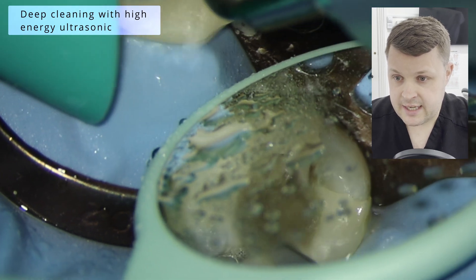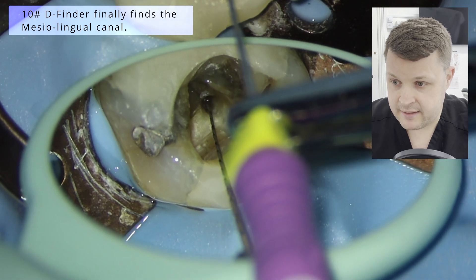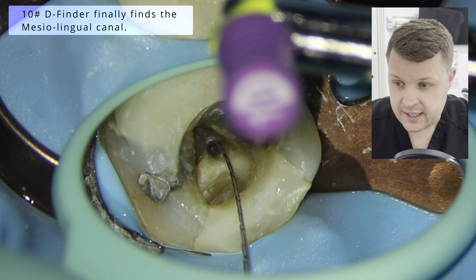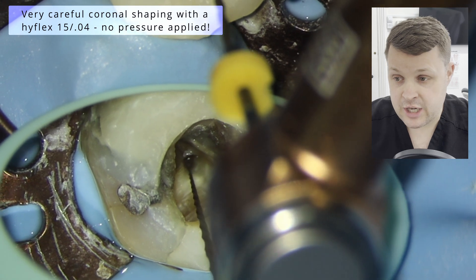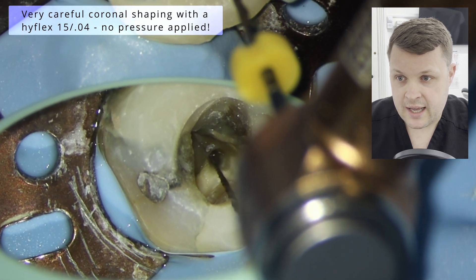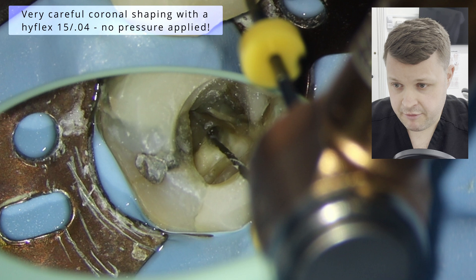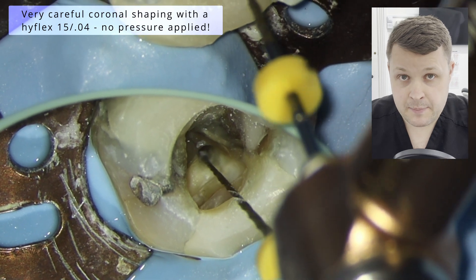Again, a quick succession of ultrasonic tips — high-energy — and then we're going to use a D-finder. The D-finder has got a tiny little bend at the end, and this is a magical tip. If you've seen lots of my videos before, you know I like to make a little bend at the end, and we finally just catch the canal orifices here. And then I'm going to use very, very careful shaping of this glide path file. Some people would like to use a hand file probably into the apical third before reaching for the glide path file, but I'm quite confident this is a strong file, I'm not pushing it too hard, and I'm just letting the file flow towards the apex.